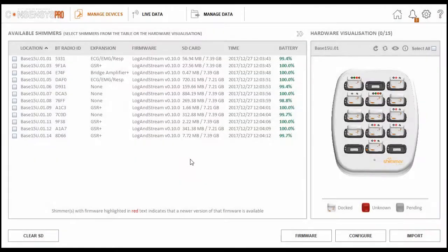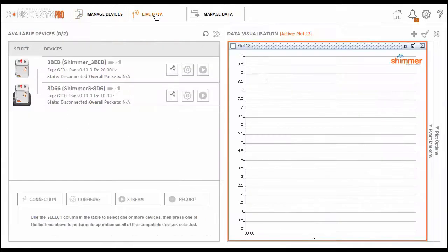Next, I am going to introduce you to the live data tab on our consensus software. This, as you might have guessed, is where live data can be visualized.